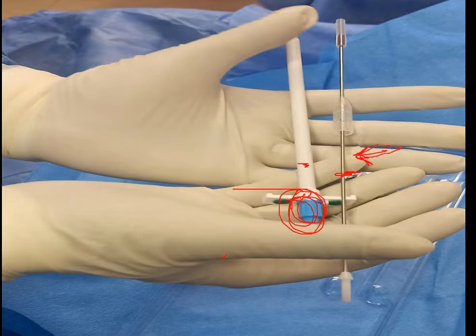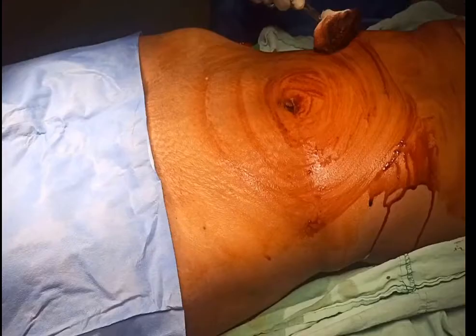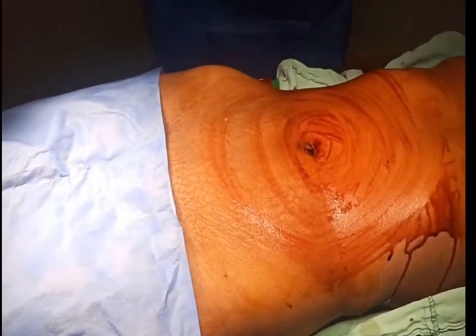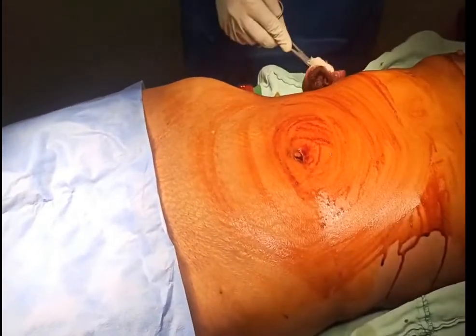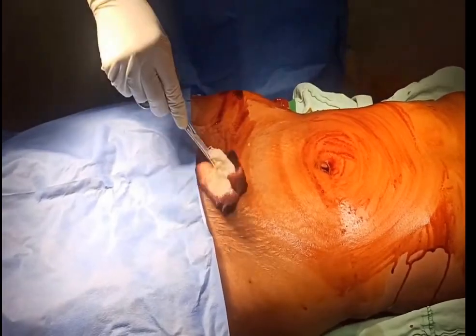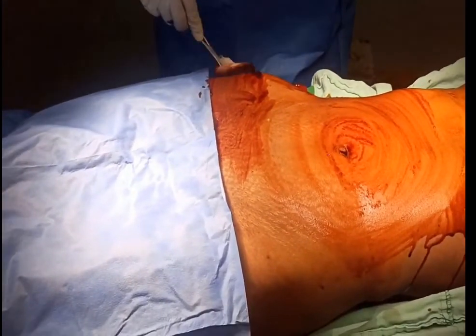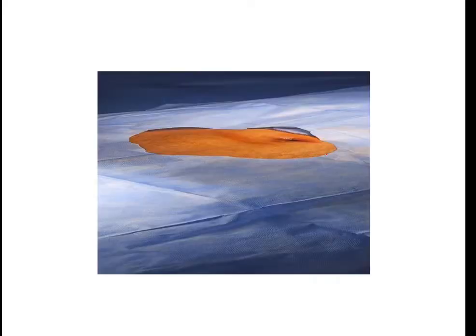The first step is to clean the abdomen — first with betadine, then with spirit. Here is a representative clip showing how to clean in a rotational motion. The entire abdomen, down to just above the pubic symphysis, has to be cleaned thoroughly. The entire area is then covered with a sterile sheet.